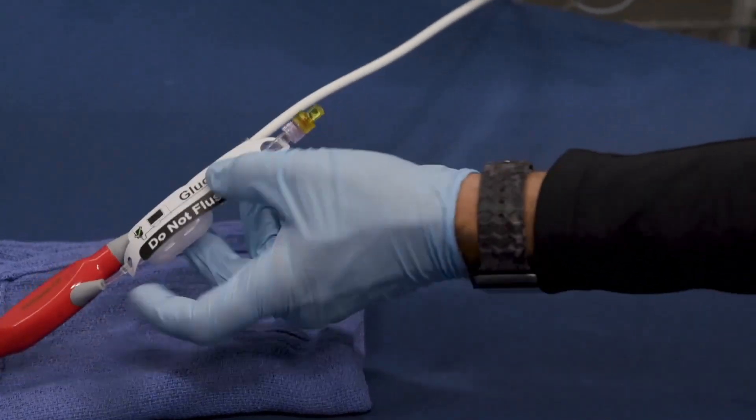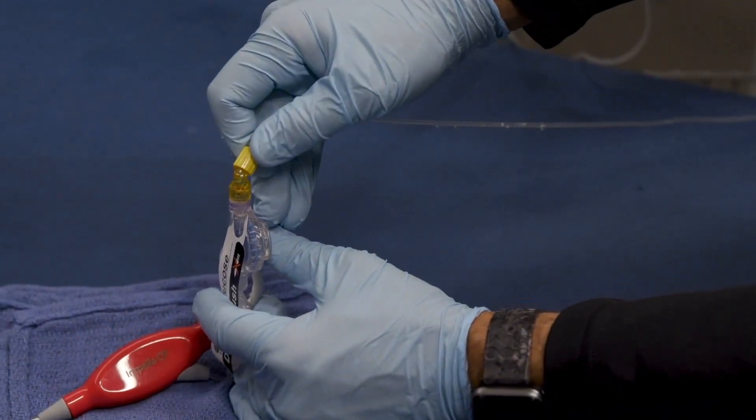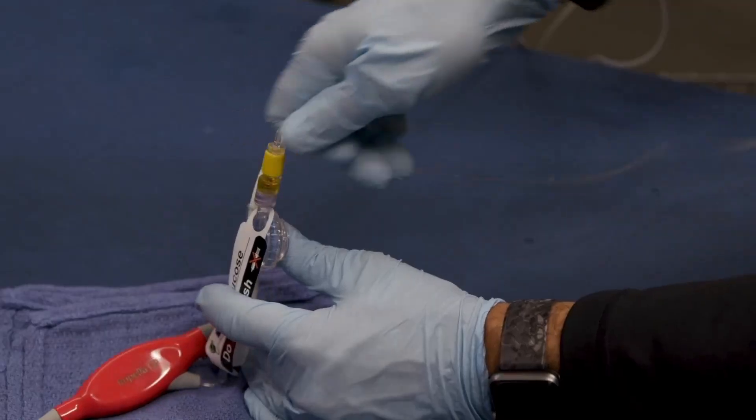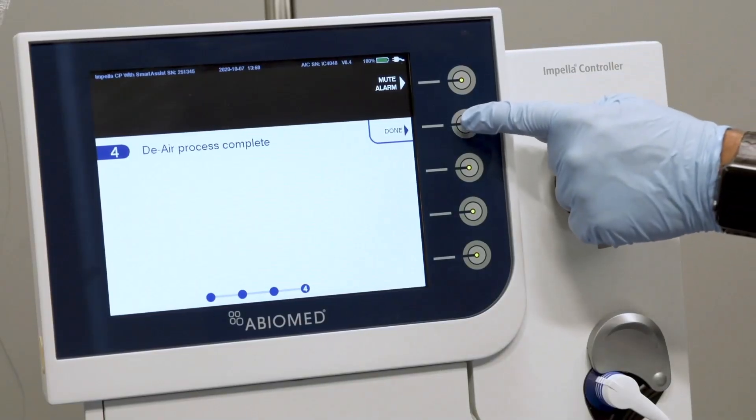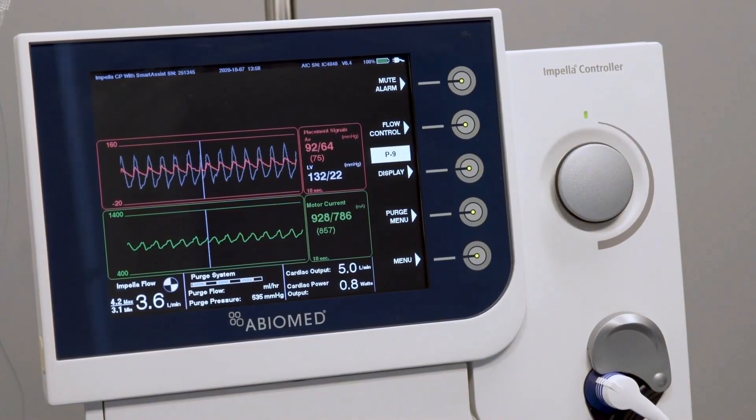Connect the yellow lure on the purge tubing to the yellow lure on the Impella catheter using a wet-to-wet connection. The de-air procedure is now complete. Press Done to exit the purge wizard.